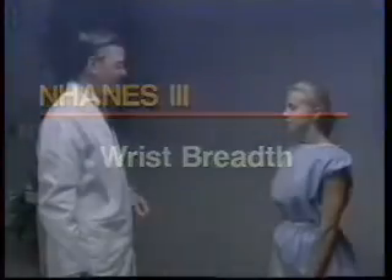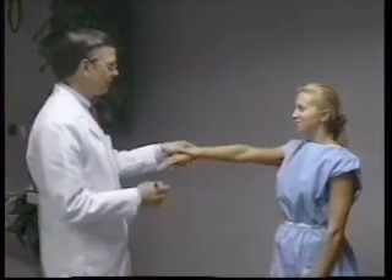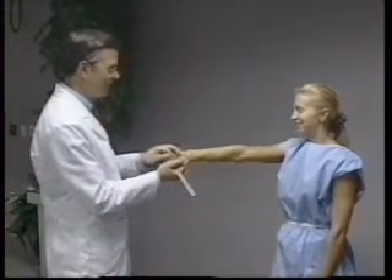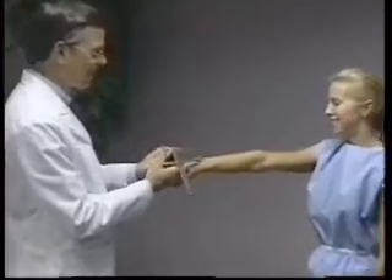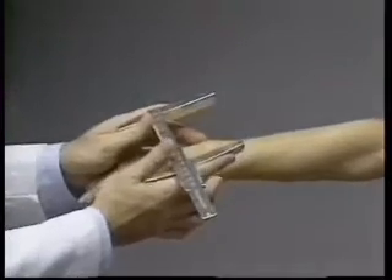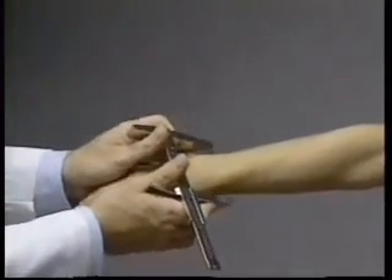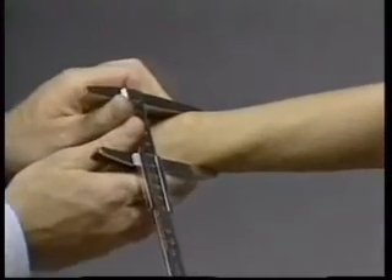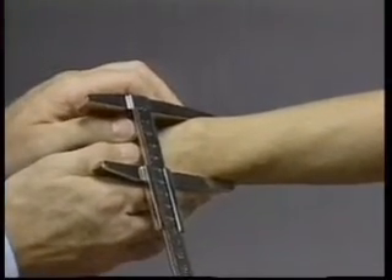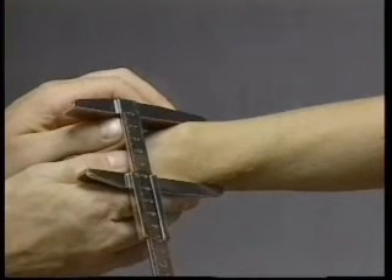The wrist breadth is measured with the subject standing. The subject extends the right arm directly to the front, with the palm of the hand down. The small sliding caliper is held between the thumb and index finger of each hand. The technician palpates the most prominent aspects of the styloid processes of the ulna and radius with the middle fingers. The caliper blades are placed on these landmarks and firm pressure is applied to compress the soft tissues. The wrist breadth is recorded to the nearest millimeter.